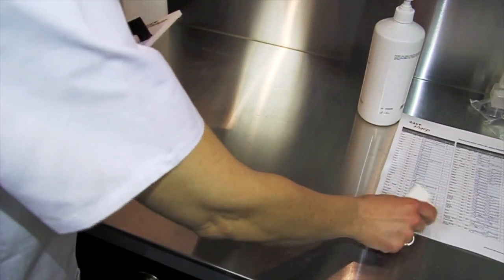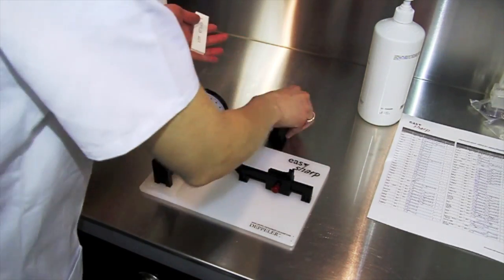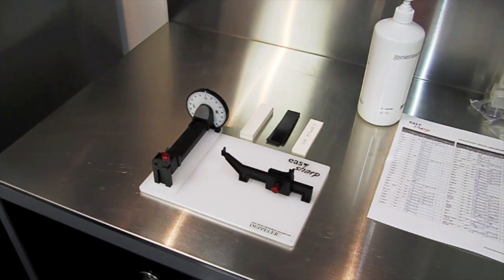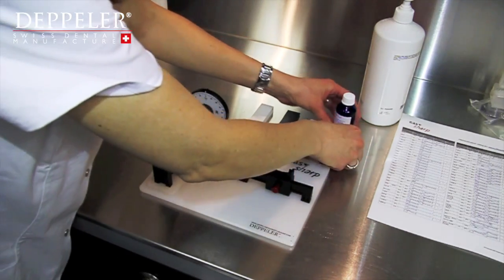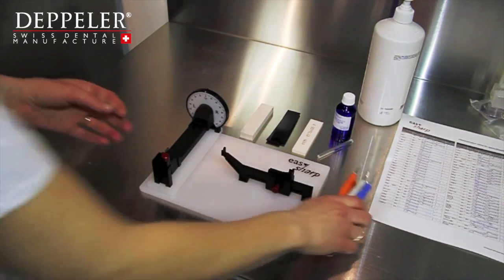You will need the following: the EasySharp appliance, the table of angles and movements, a black rubber spacer supplied with the appliance, sharpening oil, a test stick, and of course the instruments you want to sharpen.